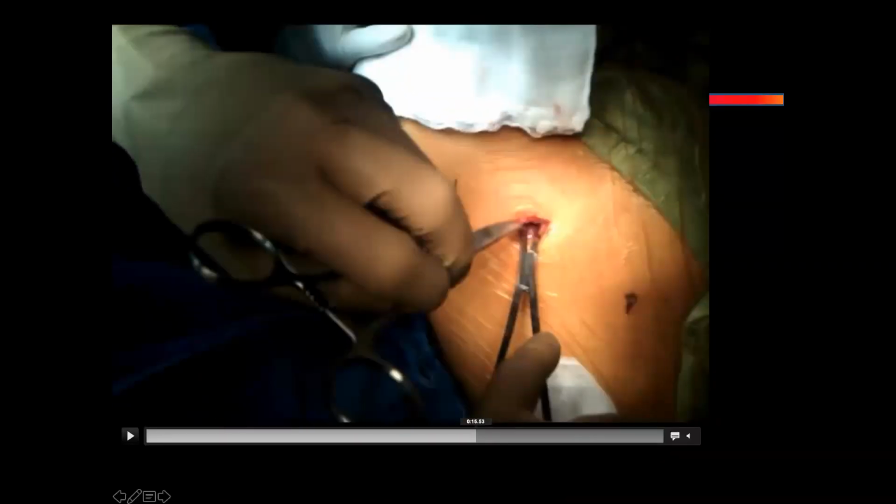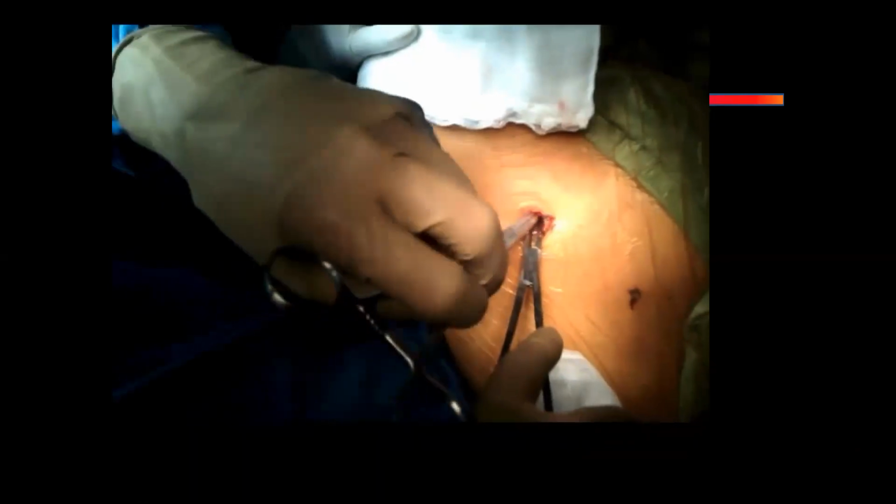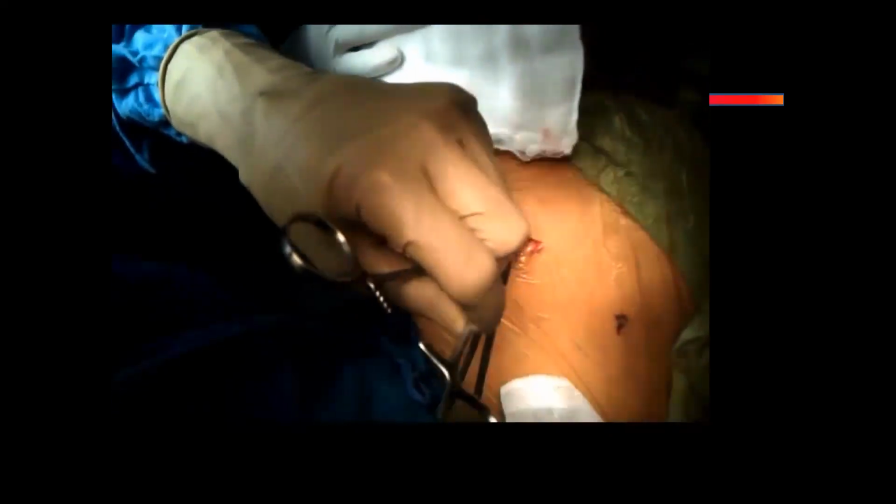Did you see that? Did you see my left hand was the guard? Yes, sir. I will show it again if you want. The most important thing is you should know how to describe this. Okay. So you have to talk. I usually use two instruments. If you have one, you can use one. It's not a problem. But my left hand is the guard. And then I dilate the intercostal space. Okay. All right. What is the next step after this?